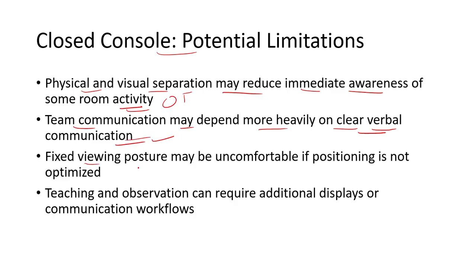A fixed viewing posture may be uncomfortable if the positioning is not optimized. He is completely putting his head into the headrest, so his posture is fixed and he cannot move left and right that much. That may be uncomfortable for the surgeon during a longer surgery.